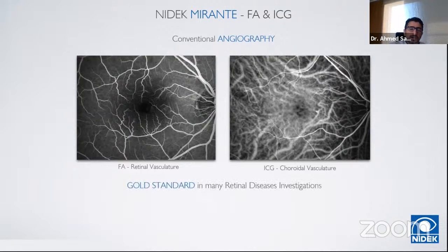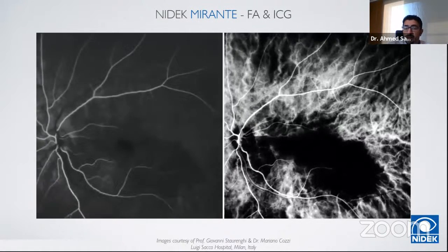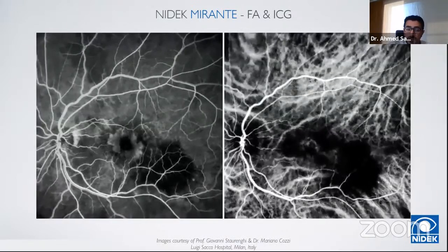And despite that OCTA has been introduced, the usage of FA and ICG imaging is still active all around the region, and it's highly requested by many doctors. I will share with you now two videos, as you can see. To the right side, this is the ICG. To the left side, this is the FA. And this is for the same patient.